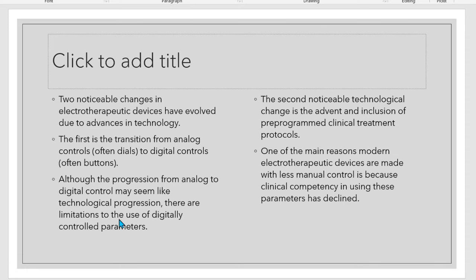So the problem is in the one who operates the device or the modality. There's a decline of clinical competency. What does it mean? It means that the one operating it either doesn't know what parameters to use with the case.